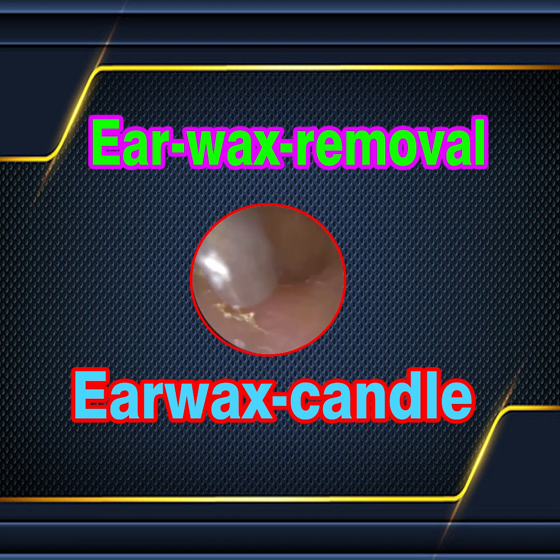And I got them to do the valsalva just to confirm the presence of middle ear effusion. If there's middle ear effusion at its early stage or resolving, so when you've got fluid behind the ear, get them to do the valsalva just gently. You're essentially forcing air up the eustachian tube into the middle ear cavity. You can get some air bubbles and it can move around in the fluid. And the patient said it looked like tadpoles and couldn't watch it. So we airdropped the video, and when they watched it back, they said, no, don't watch this. It made them a bit nauseous. It just gave them that appearance of tadpoles behind the eardrum, which is obviously a bit gross.